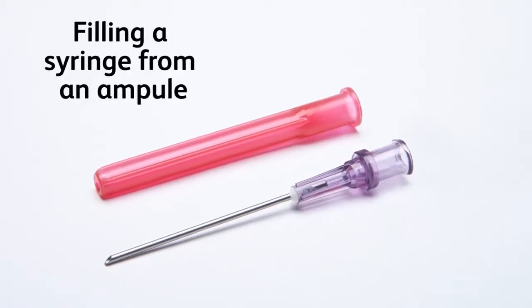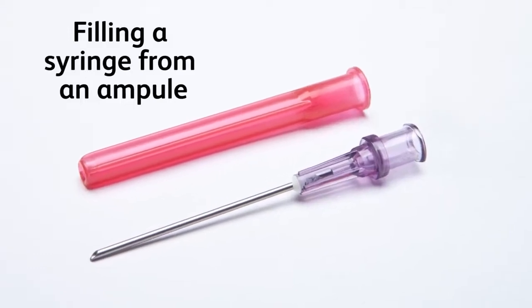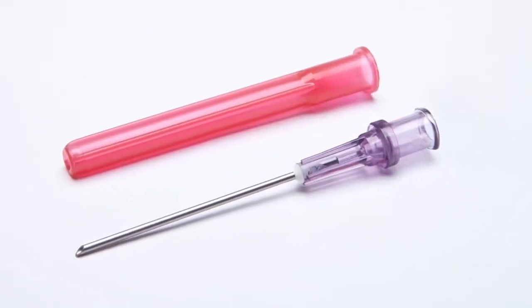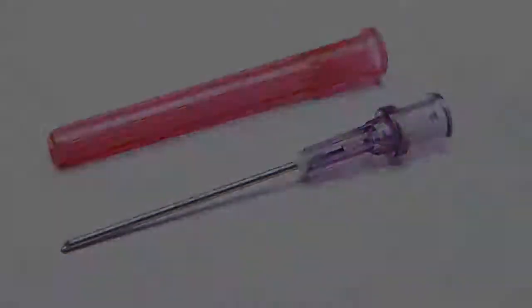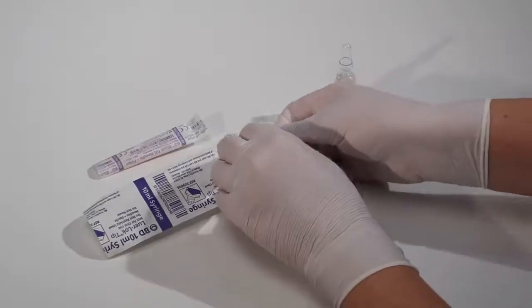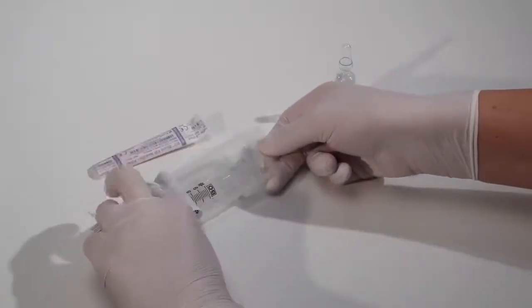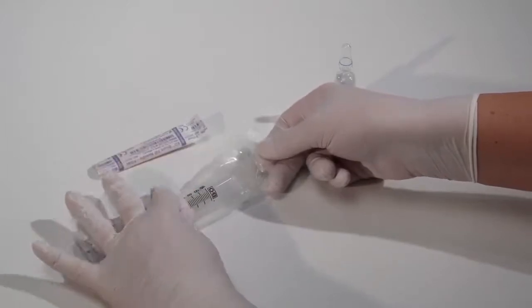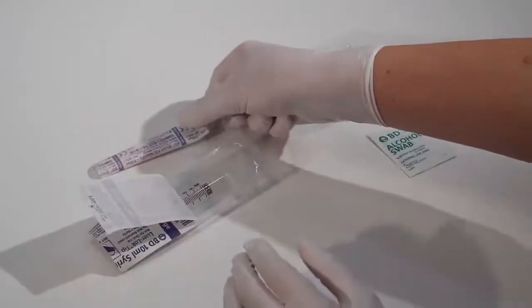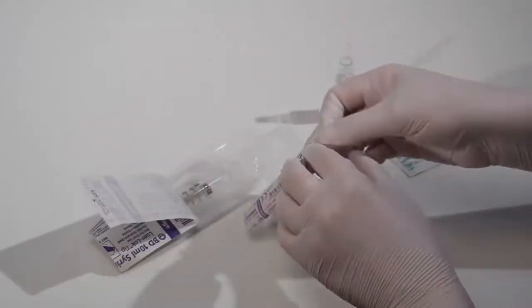Sometimes a clinician needs to remove medication from an ampoule. To do this, you'll need a blunt filter needle rather than a blunt fill needle. Open the syringe and blunt filter needle packages by holding the peel tabs and peeling them back only far enough to expose the hub of the needle or the plunger rod of the syringe.